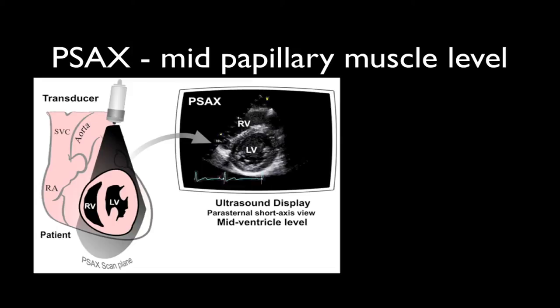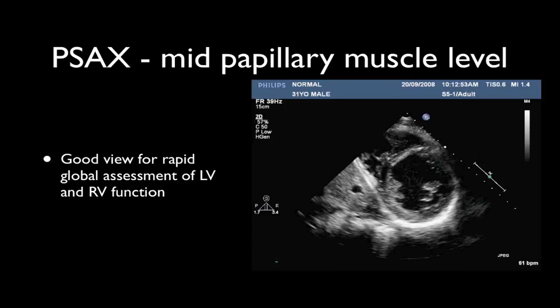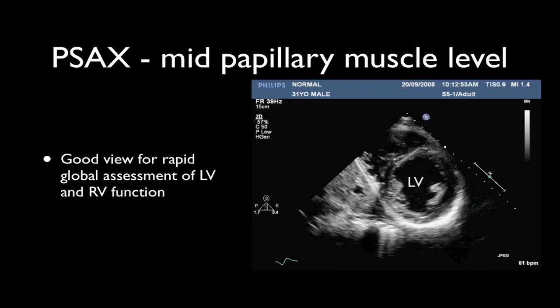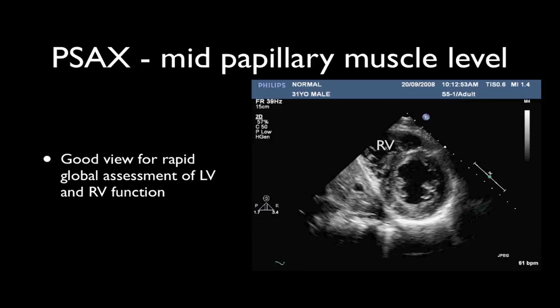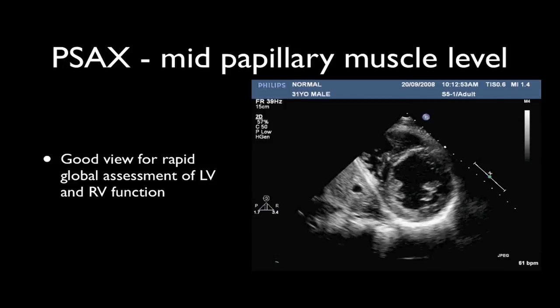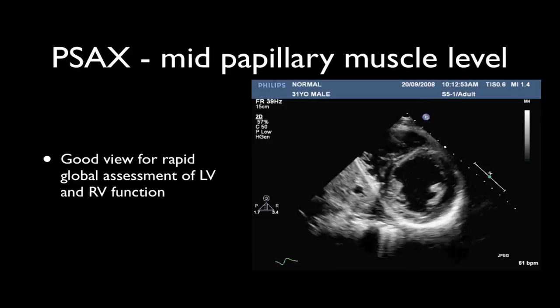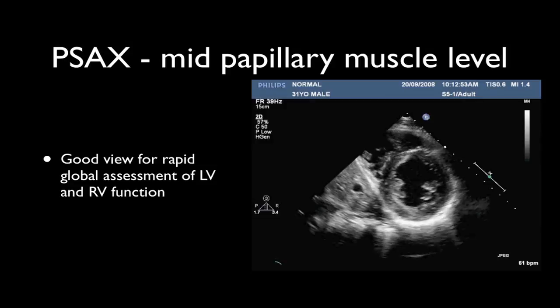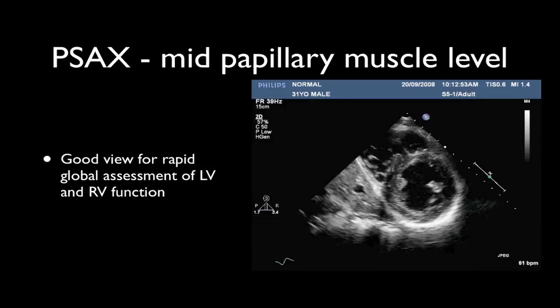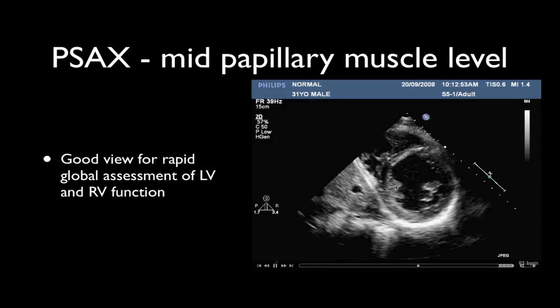Moving towards the apex, we get to the mid-papillary muscle level. This is a particularly good view for rapid assessment of global function of the left ventricle and the right ventricle. In this example, we're looking at a normal 31-year-old heart — that is a normal contracting, dancing donut. Here we see the medial and lateral papillary muscles.